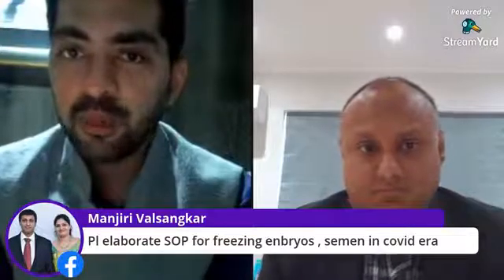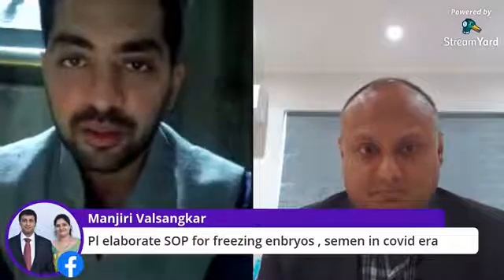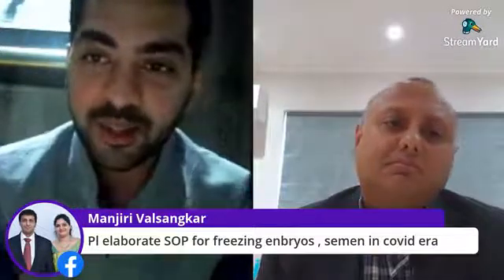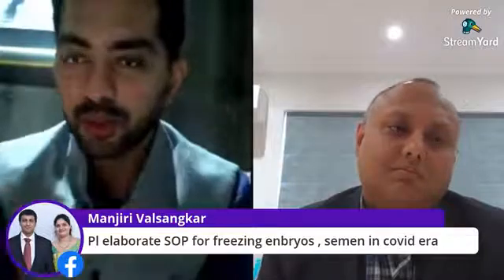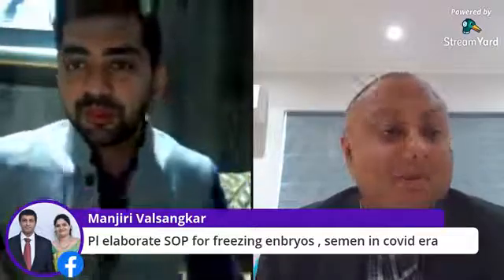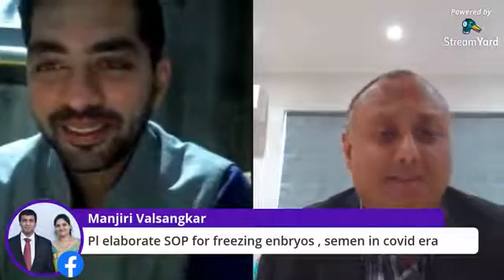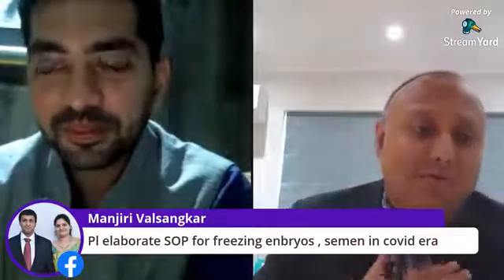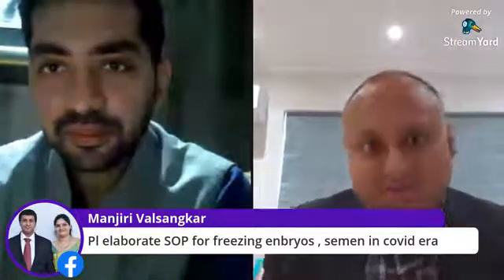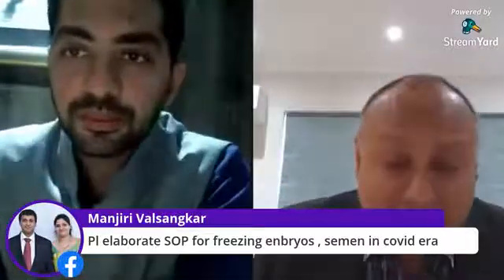Now let's move on to our protocols. Will closed systems be mandatory for such patients now, or can we still think of open systems with separate cryocans? You were talking about closed systems a few minutes ago. We were having this debate yesterday in the WhatsApp chat of all the lab managers in the UK. There have been variable approaches taken by several labs. In my lab, anyone who becomes symptomatic or tests COVID positive, if they are a cancer patient, etc., would go in a closed system.